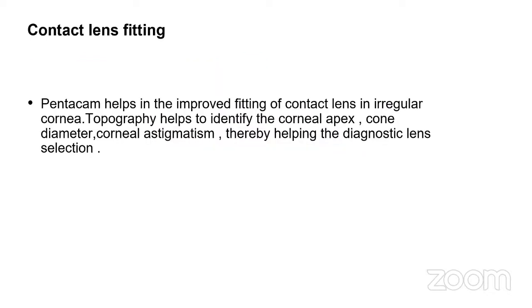Contact lens fitting. The Pentacam helps in the improved fitting of contact lenses in irregular corneas. The topography helps to identify the corneal apex, cone diameter, and corneal astigmatism, thereby helping the diagnostic lens selection.